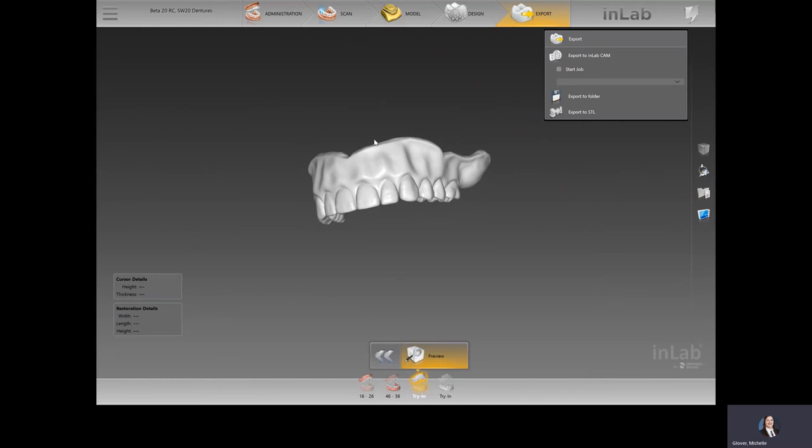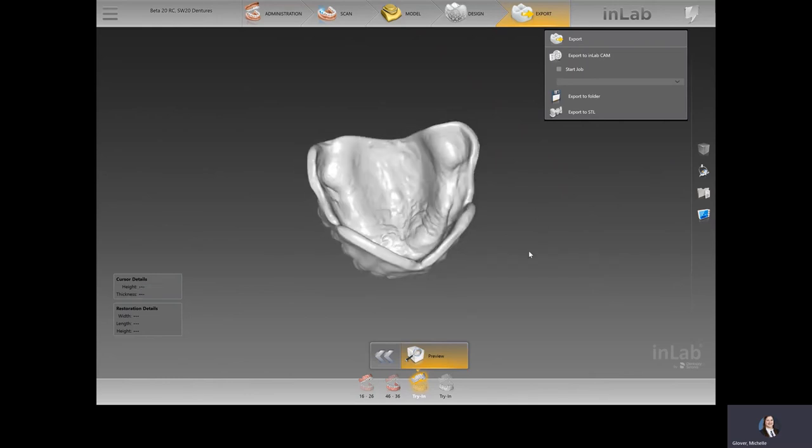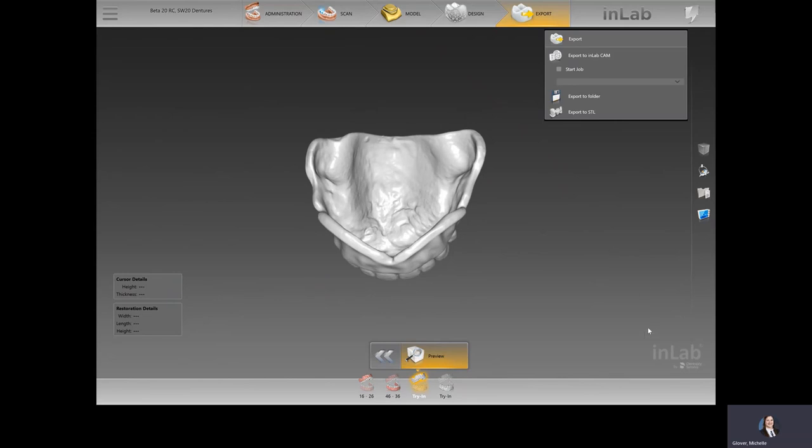where you're able to design with the digital IPN 3D teeth. So that's using the denture tooth workflow. I'll come back for another video to discuss the workflow with the individual tooth workflow, which is where you're able to design the teeth yourself to either mill them and then mill the base, which is probably the most commonly used workflow.